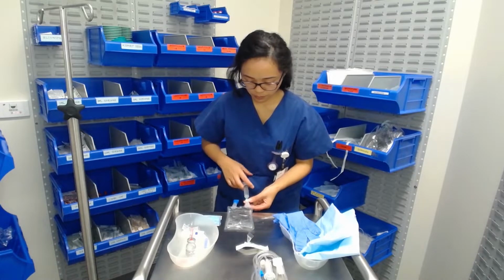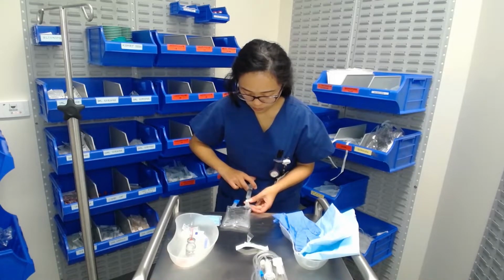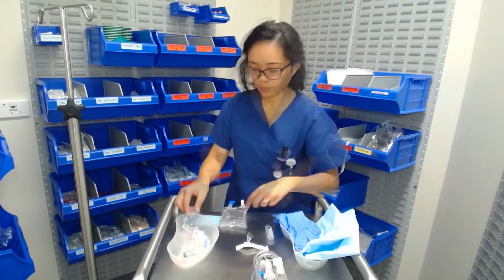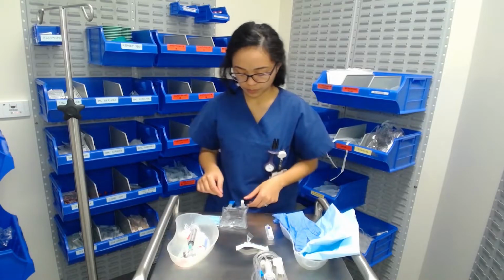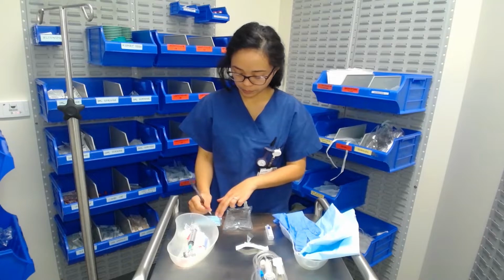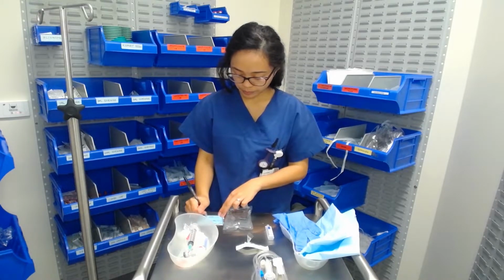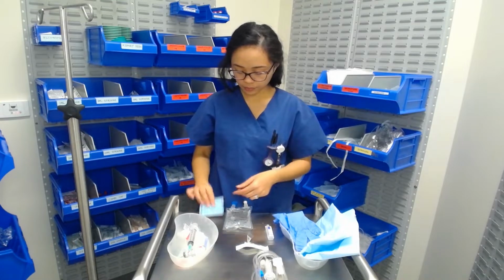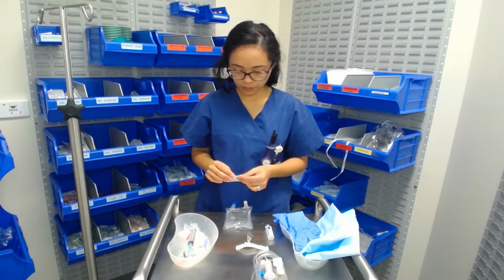Remove the needle cap from the syringe and insert the needle of the syringe through the center of the injection port at the site. Inject the medication. Withdraw the syringe from the bag. Mix the IV solution by holding the bag and turning it gently end to end, and this allows the even distribution of the medication. Complete the medication label.